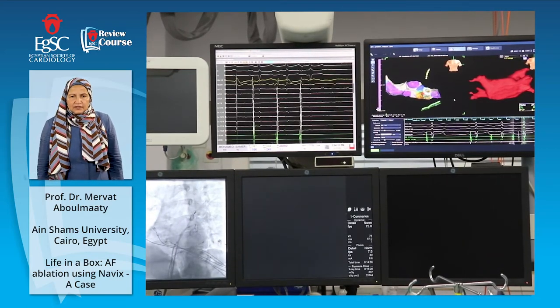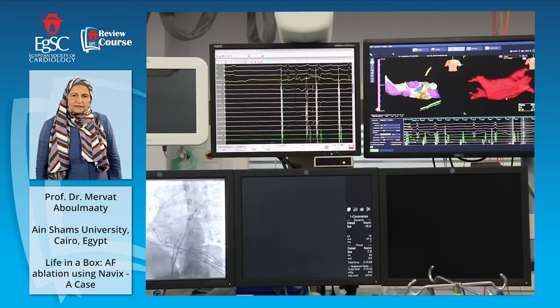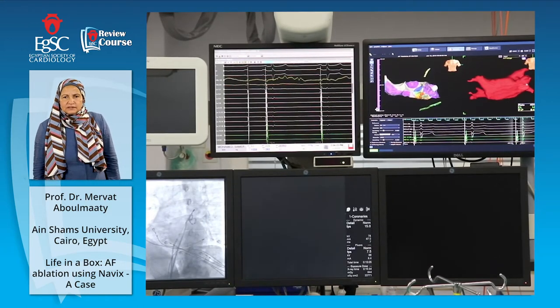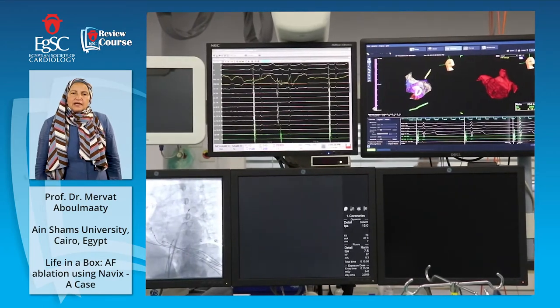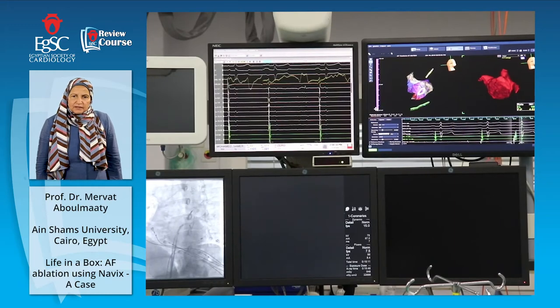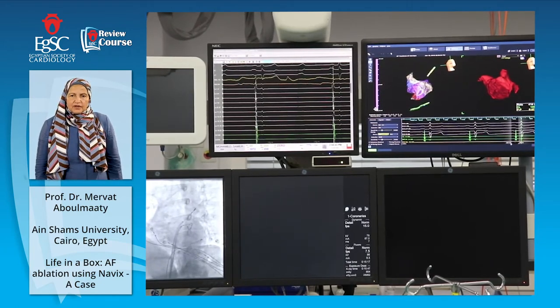You can see the catheter down is the CS catheter at the arrow. And the circular catheter is getting signals here. I'm now getting mapping with this catheter. We can get a voltage map at the same time, and the purple is the good healthy tissue. We can get a voltage map and we can get an anatomical map. The circular catheter is moving around, as you see. Yes, I'm getting good signal. I'm making a good map.